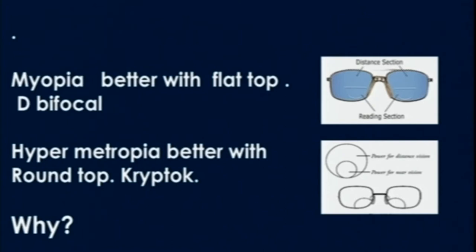Better is always for myopia patients, you can see, a flat top bifocal. You know why? In myopia, it is a concave lens for the distance. So the optical center of the distance portion and the optical center of the near vision portion are very close. When they are very close, the jump is relieved. Suppose it's far off, naturally the jump is more. That's why, please remember, better for myopia is flat top.